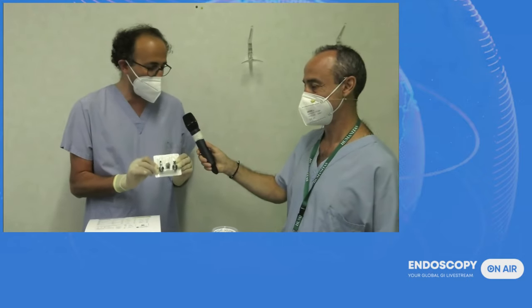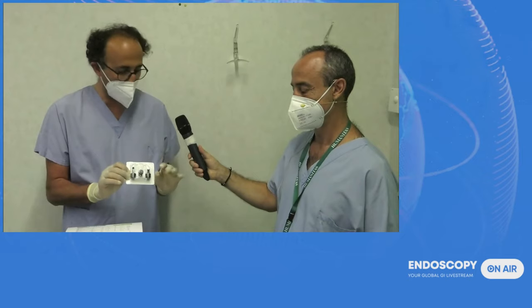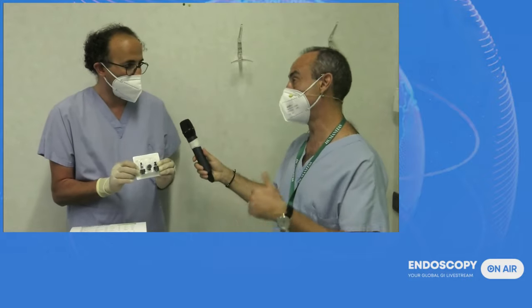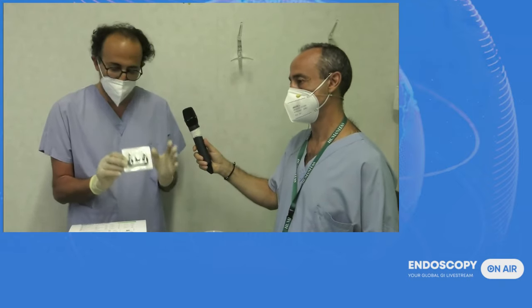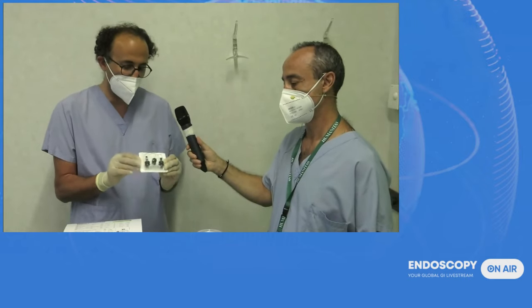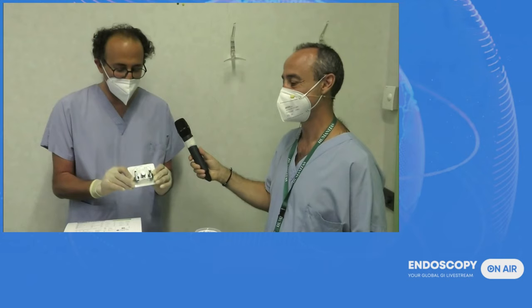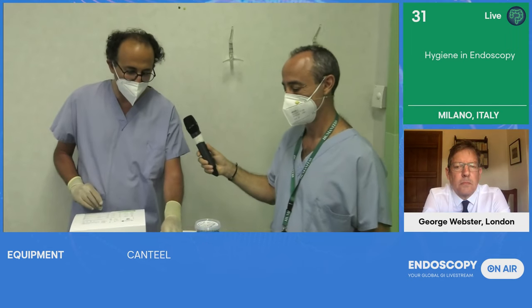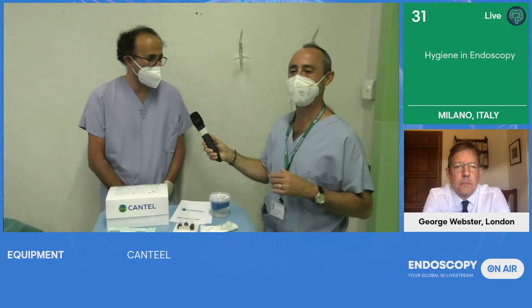This is not unexpected, Ale, because other studies previously done show the same. But this study, on over 1,000 procedures, also assessed the satisfaction of the endoscopist, and I would say the nurses and technicians in charge of cleaning. Absolutely. So did we replace this single use? Less than 1%, with no difference. And in addition, there is a trend for better satisfaction regarding what is, in my view, the most important, the air-water valve, because you need to insufflate the colon or the upper GI. These are the results of this study, extremely exciting, and the ESGE strongly recommends it.